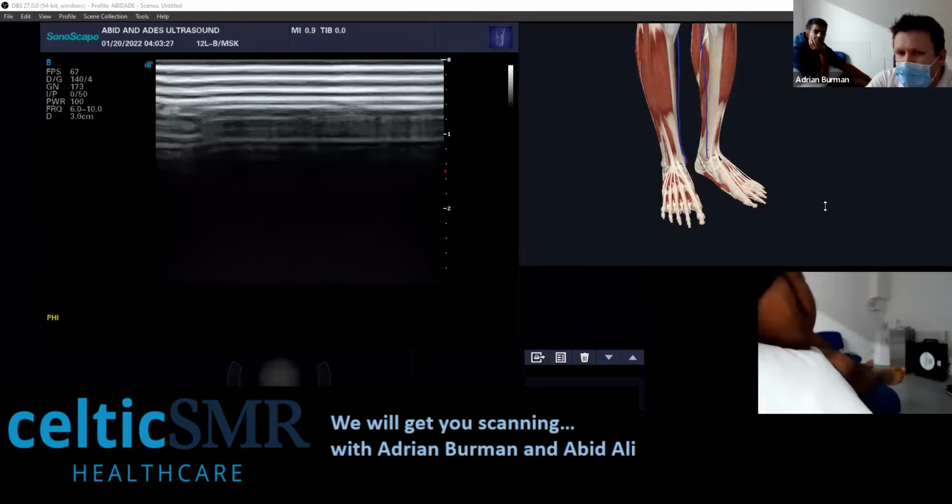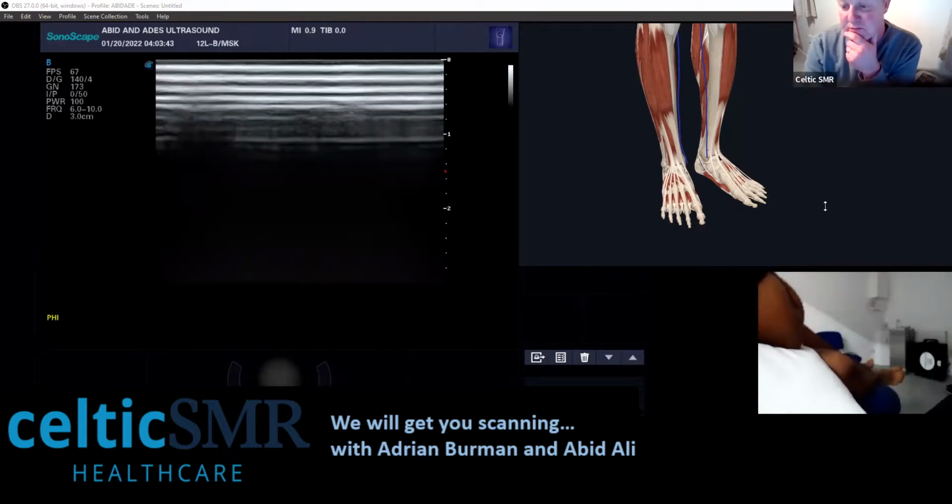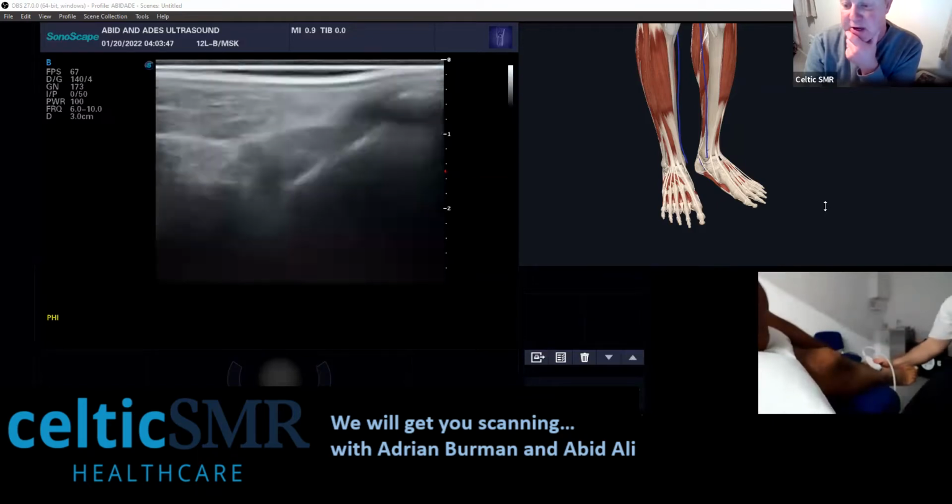Just a bit of a revision or support on that one. Lateral ankle ligaments too, please, and peroneals.